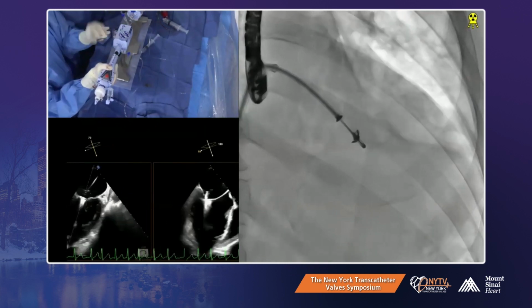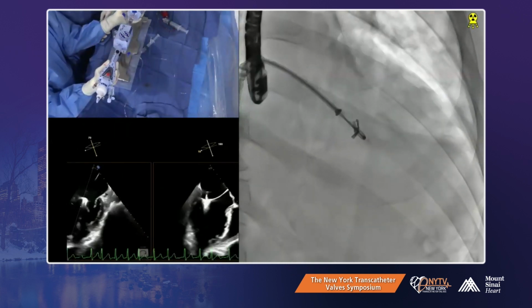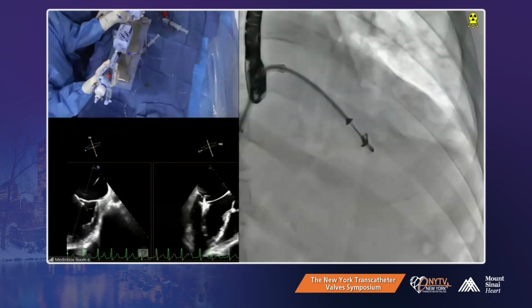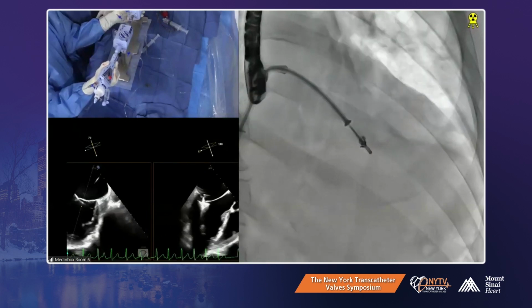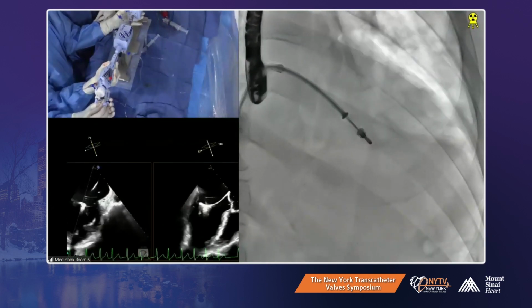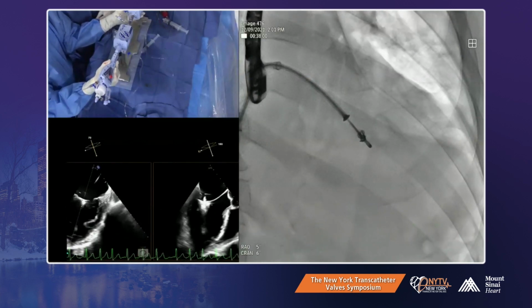Okay, I think maybe we didn't go in ventricular enough, perhaps, that's why. You might be fighting the belly of it. Could be. Here, that's now more ventricular. Take note of your intercommissural trajectory. Coming from lateral to medial, you see that, right? You think we're not ventricular enough, that's what you're thinking, right?